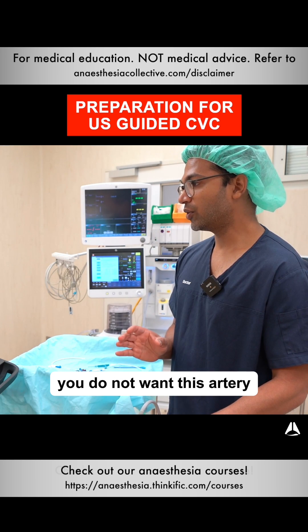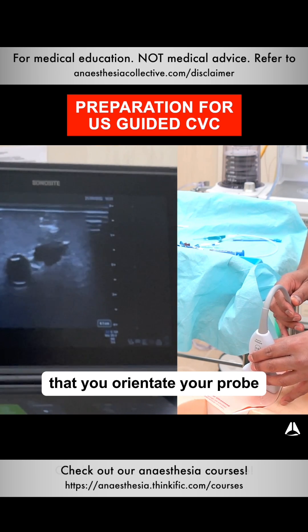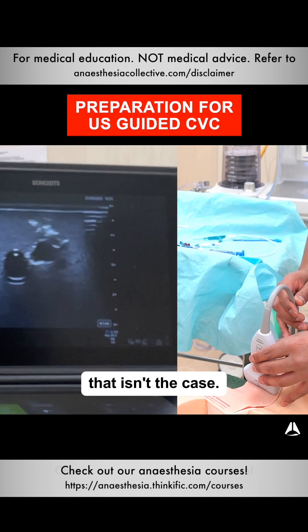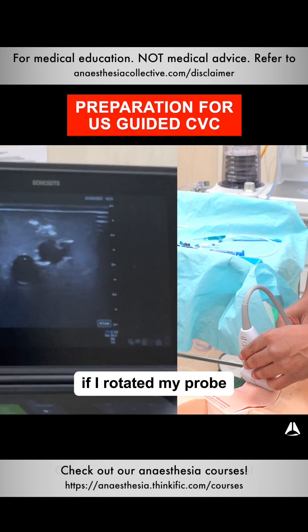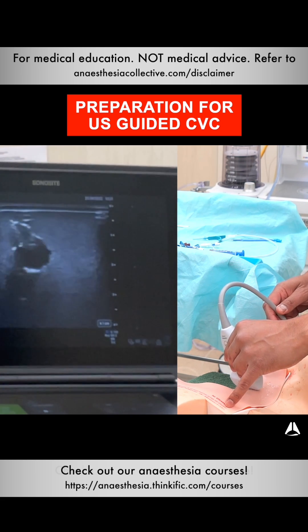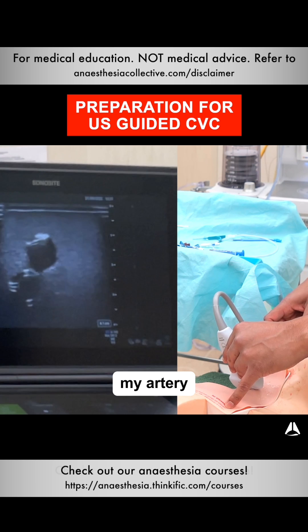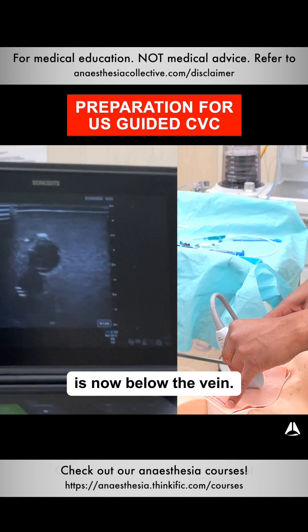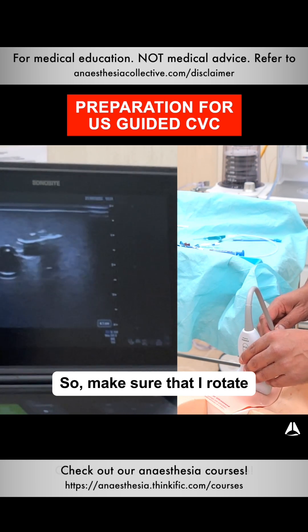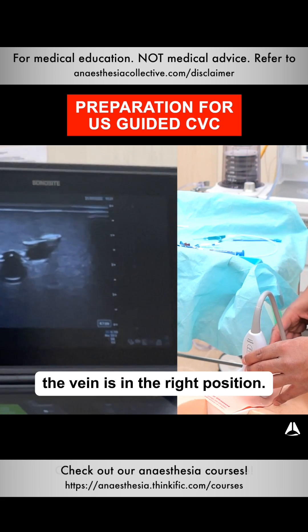One thing to point out: you do not want this artery to be directly underneath the vein. So you make sure that you orientate your probe such that that isn't the case. For example, if I rotated my probe to this side like that, my artery is now below the vein. So make sure that I rotate and reposition my probe such that the vein is in the right position.